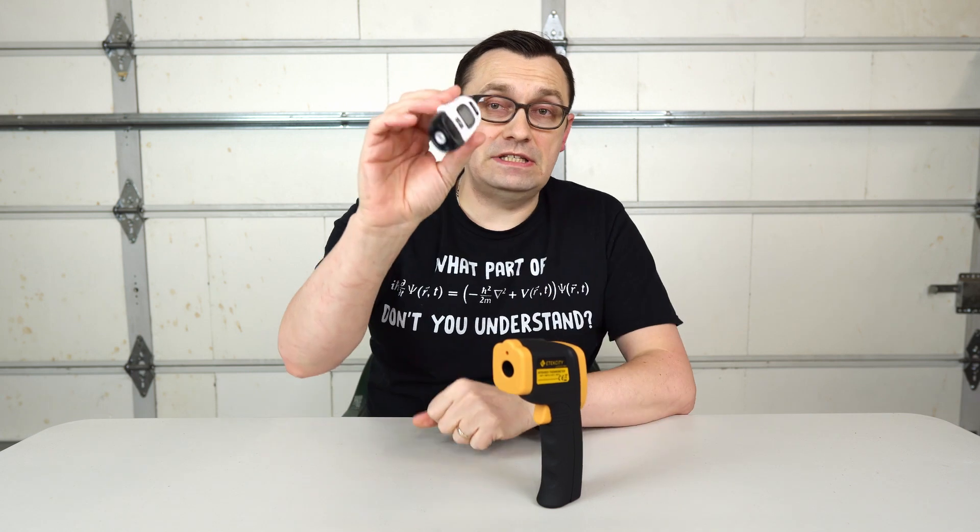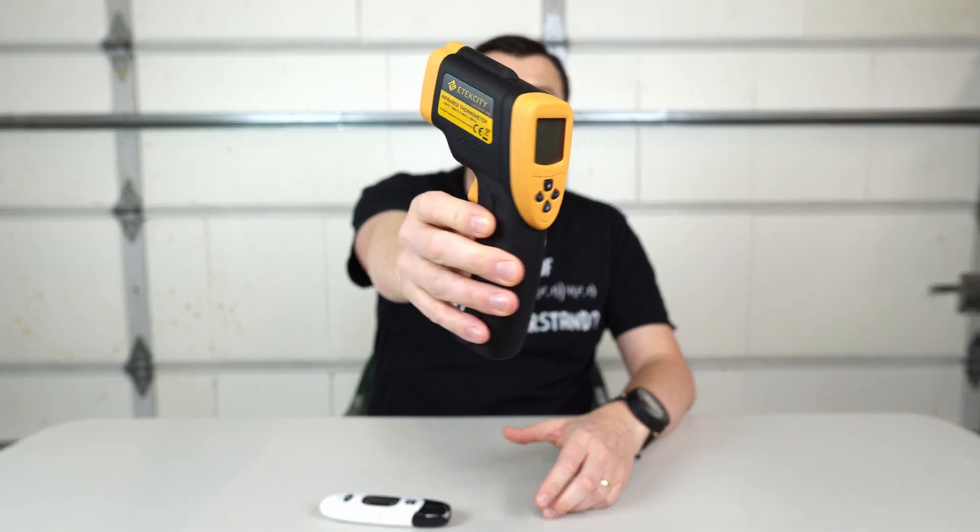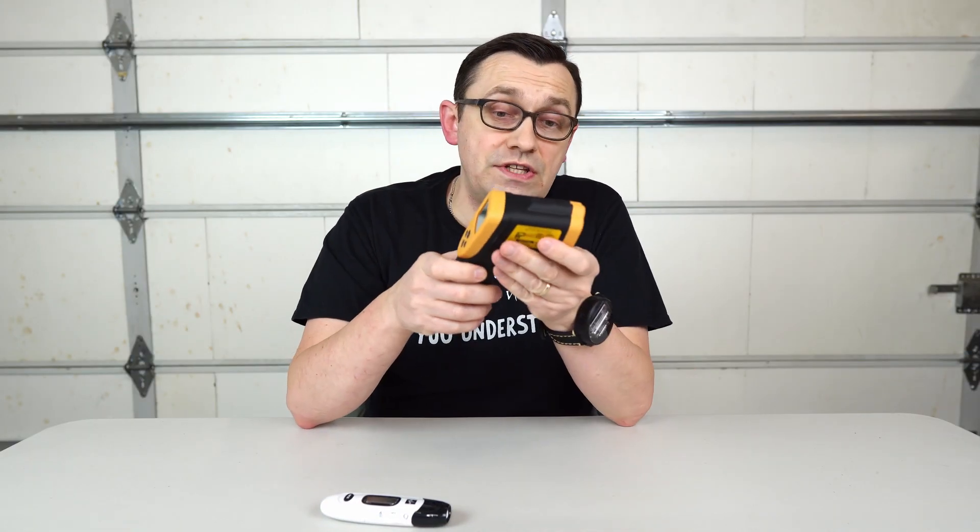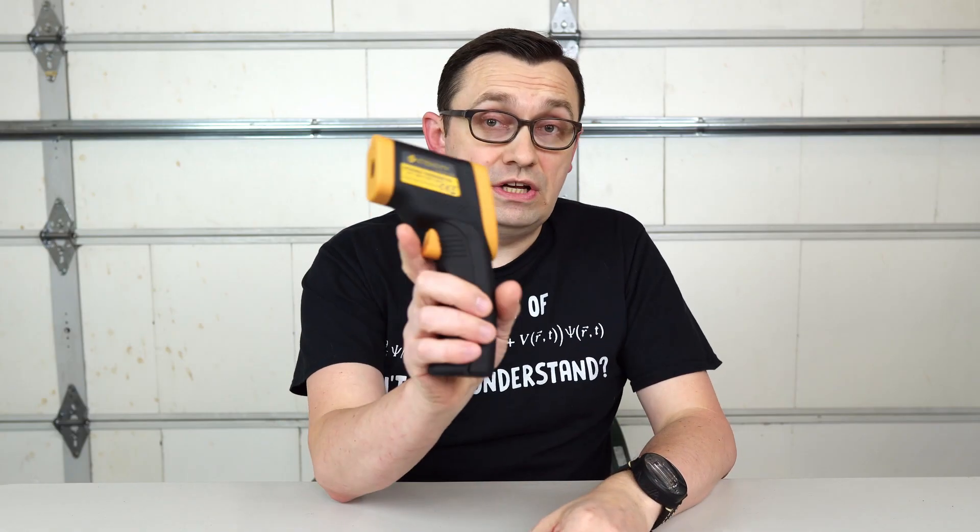This thermometer is obviously designed just to check body temperatures for babies and adults. And this one is actually a multi-purpose thermometer. It has a huge range of temperature degrees that you can test, things like minus 58 degrees Fahrenheit to 1382 degrees Fahrenheit. That's a huge range of temperature.